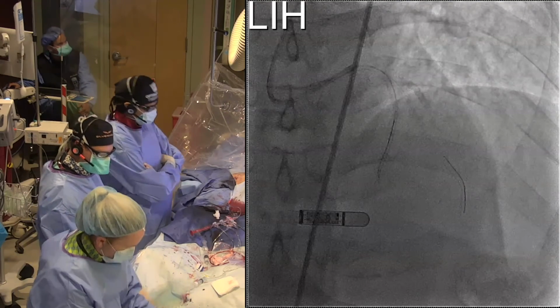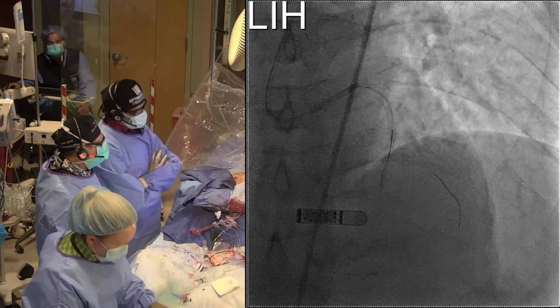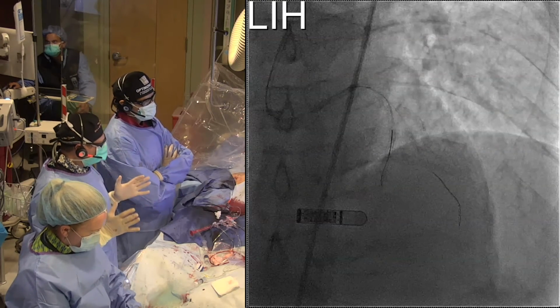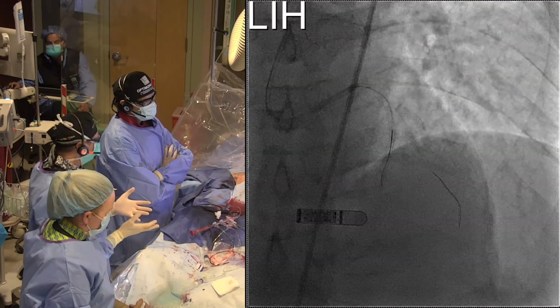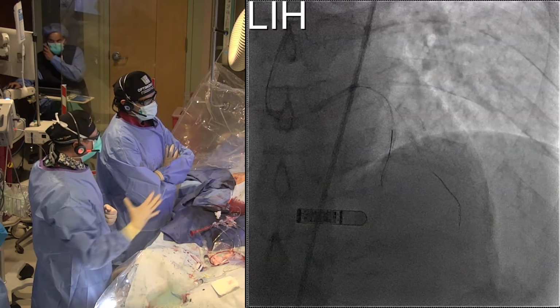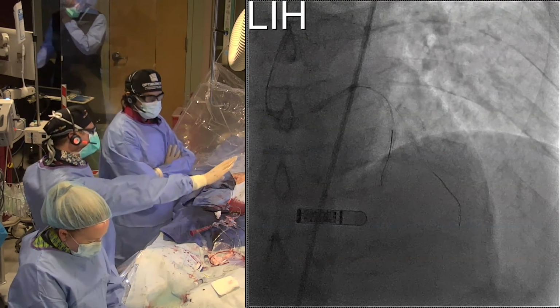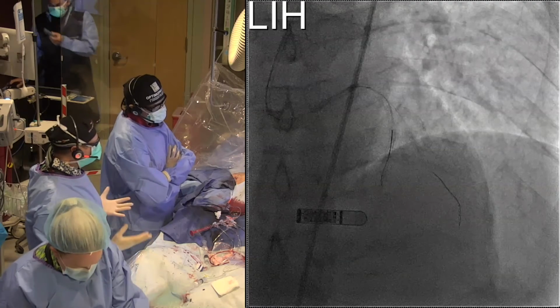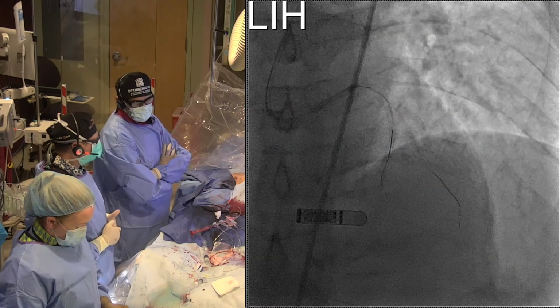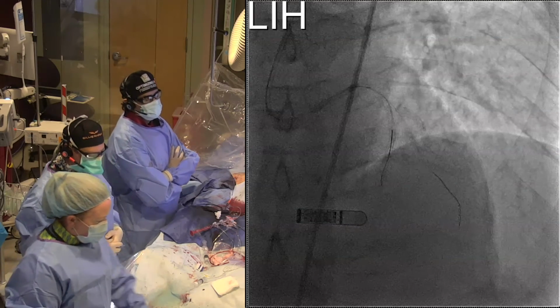You know, I never fail to get surprised with this physiology. We're wrong so often. And the thing that really annoys me, to be perfectly honest with you, is somebody takes the trouble, the effort, to do a distal measurement, and it's abnormal, FFR, iFR, whatever you want to do. But then you suddenly switch off this idea that you need physiology, and you now go by the angiograms. Oh, these two lesions are significant, I'm going to stent those. How in the world can you tell? You can't. I think you showed that in DEFINE PCI. It's just unbelievable. But that's the mindset, honestly, of 90% of interventionalists. That's the issue.